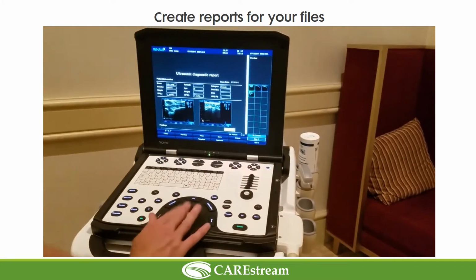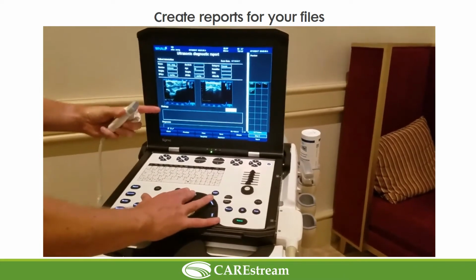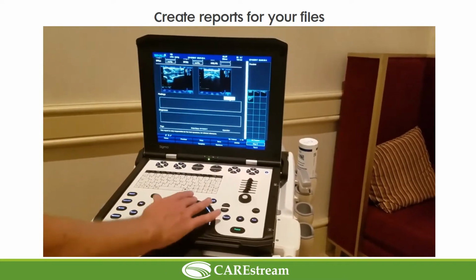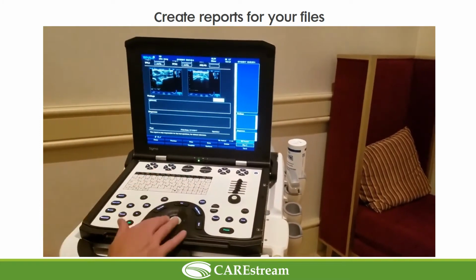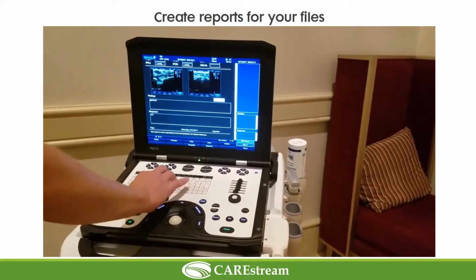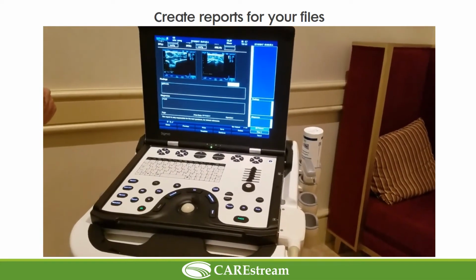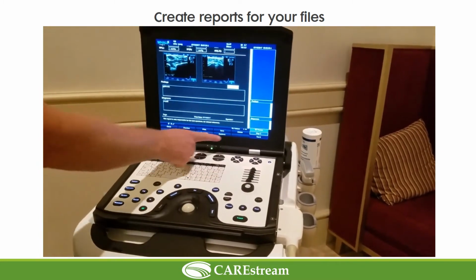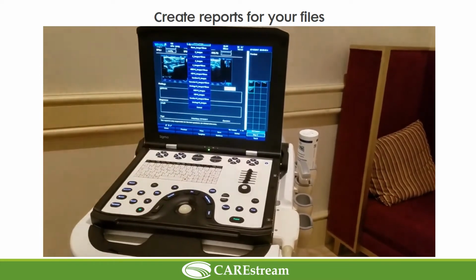There it is. If we scroll down the screen, we can type in our text. So insert text, and now we can type whatever we like, and the diagnosis of whatever we like. And hit save, which is this top soft key. There's save, print, retrieve, and template.